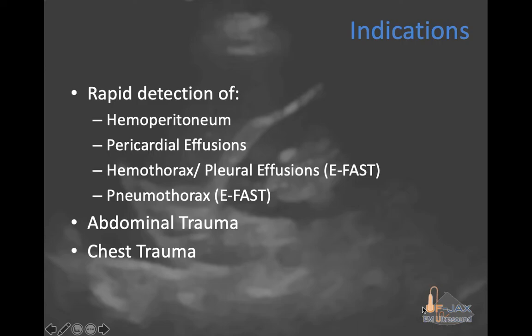Early detection of pericardial effusions can prevent cardiac tamponade in cases where a wound to the heart bleeds into the pericardium, not the chest cavity. This may occur when the pericardium seals itself after penetrating injury. Thus, all patients with penetrating chest injury should be screened for a potential pericardial effusion. If an effusion is present, cardiac injury is assumed until proven otherwise. The extended FAST exam can be used to detect hemothorax after penetrating injury and is actually more sensitive than the standard supine chest x-ray. Ultrasound can detect as little as 20 cc's of fluid in the chest.